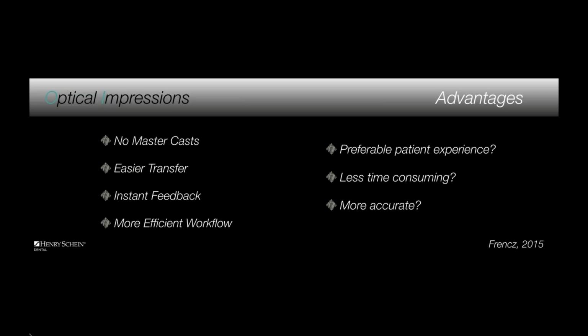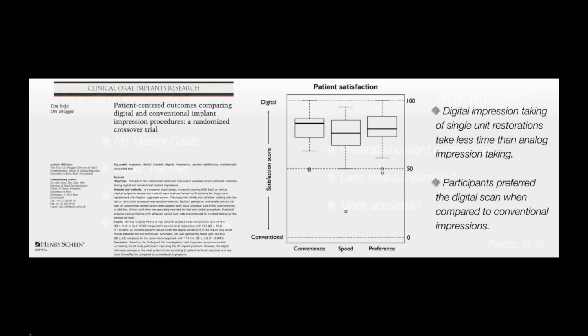It takes less time, and is it more accurate? And when we look today, we know that digital impressioning for sure takes less time than analog impressioning. And this is good literature that supports this for the single tooth application. I would espouse that in today's world, and what I will show today, even when we're doing complex full arch natural tooth dentistry, digital impressioning allows us to be much quicker because we capture more information in one bout than we can with the analog approach.